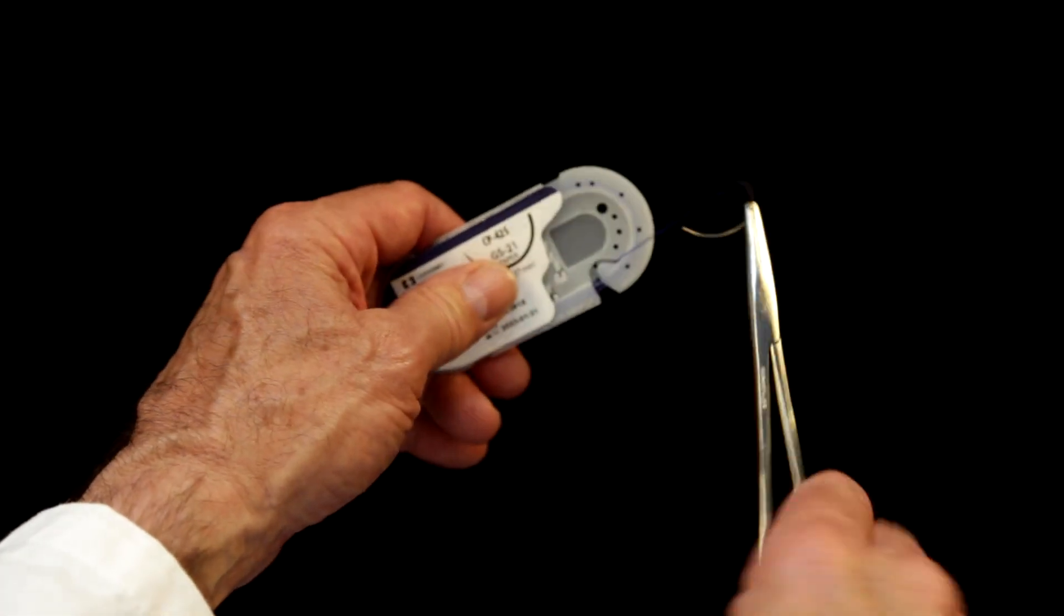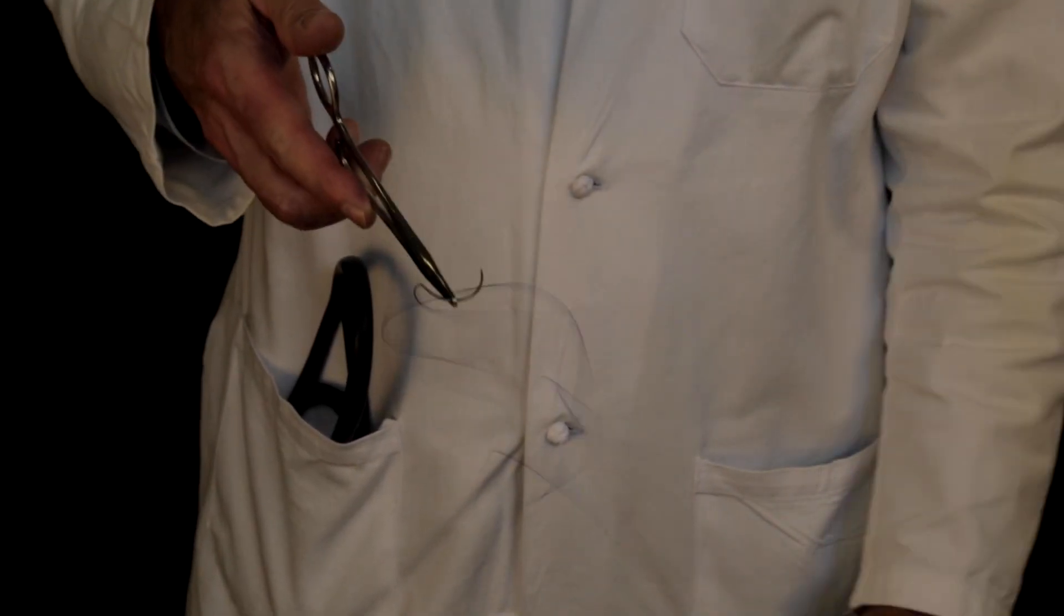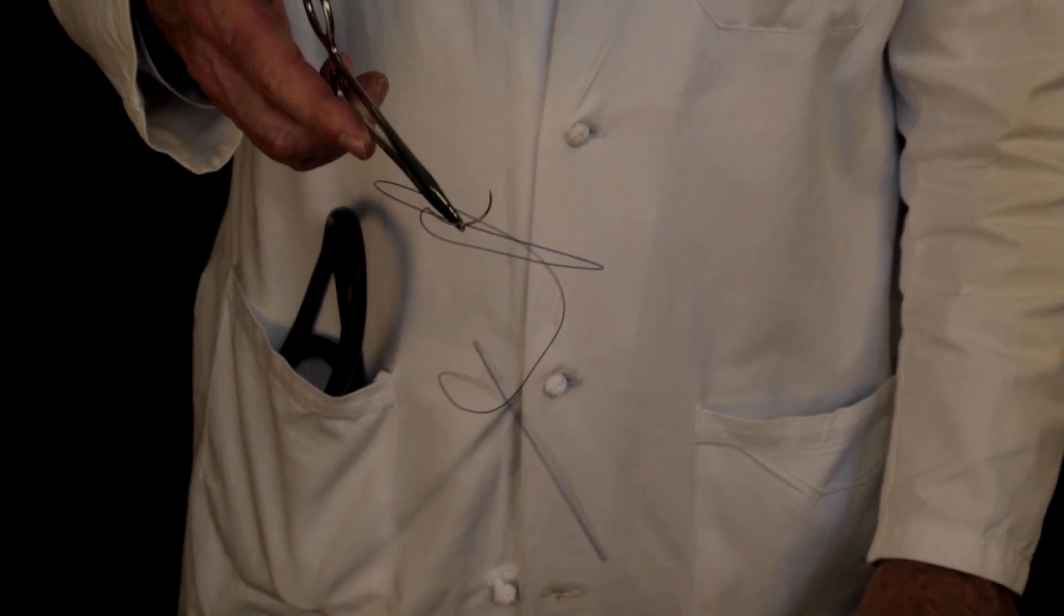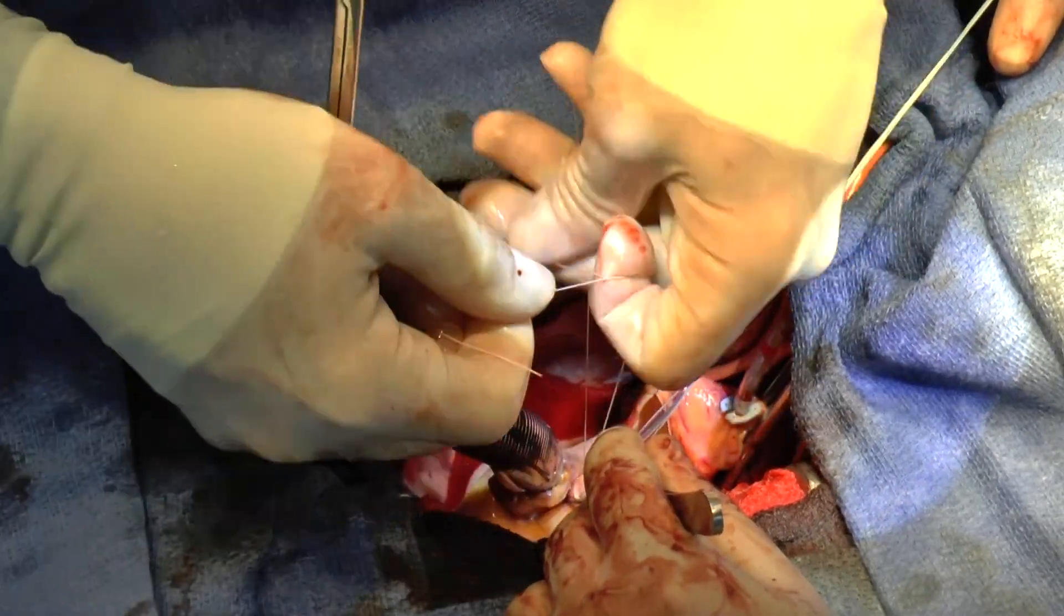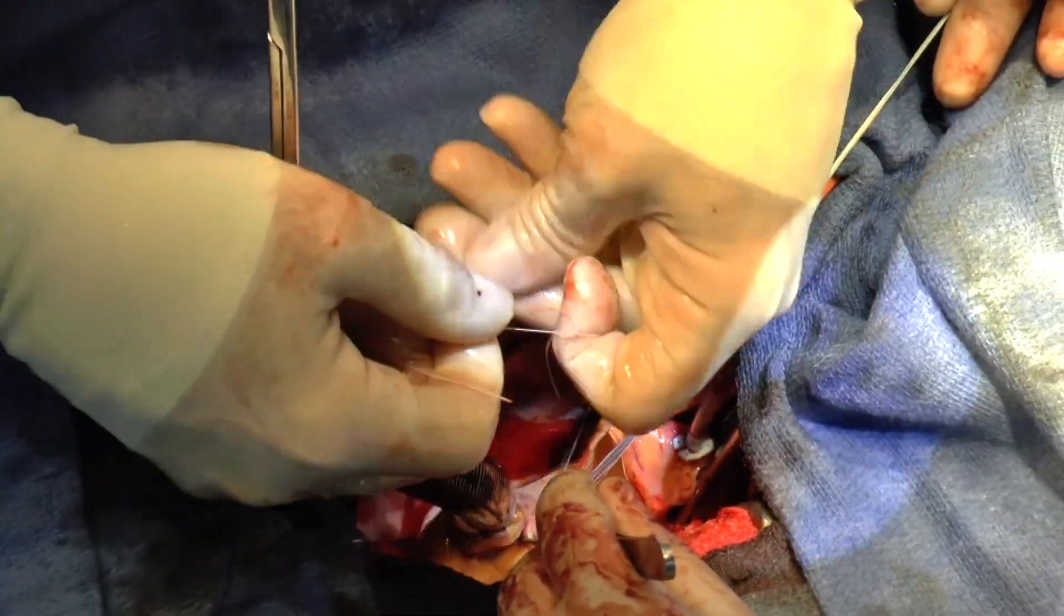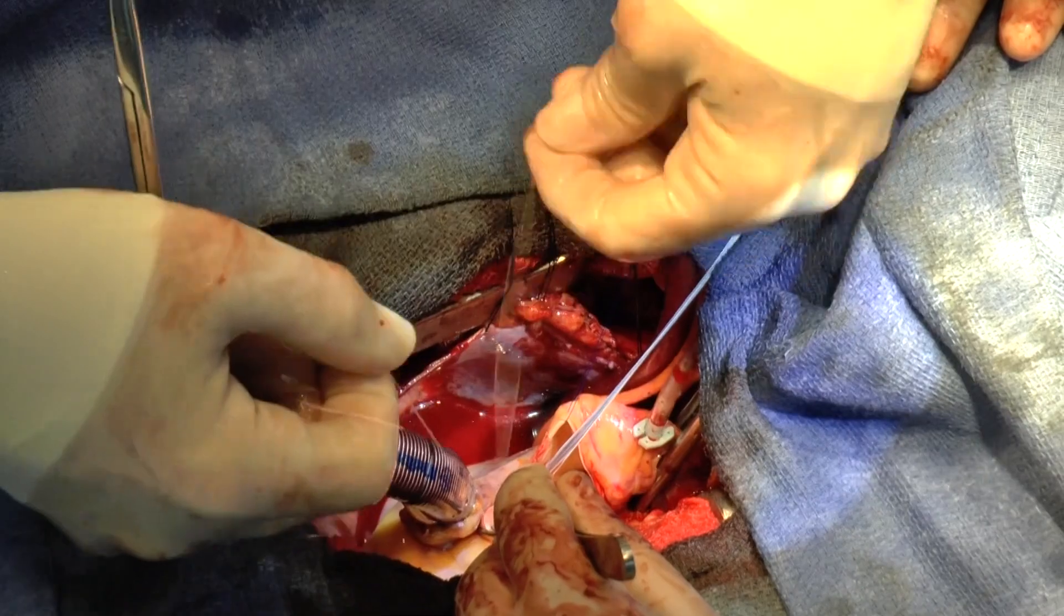In heart surgery, we're usually tying with suture material that has substantial memory and therefore a tendency to untie. So we throw several more locking loops. But virtually all of the tightening is done with the first two loops.